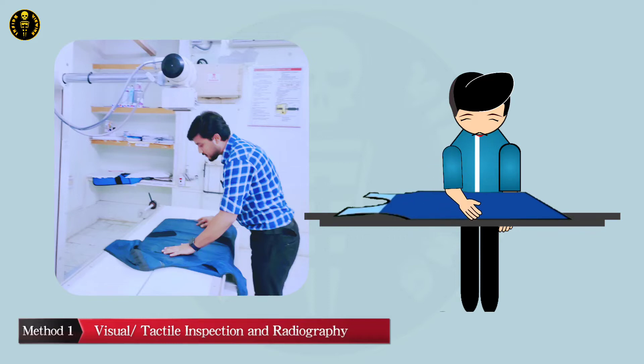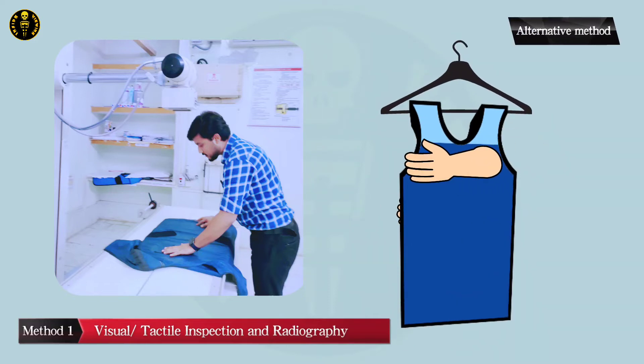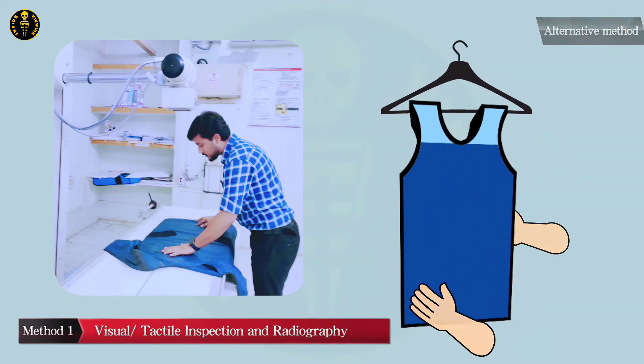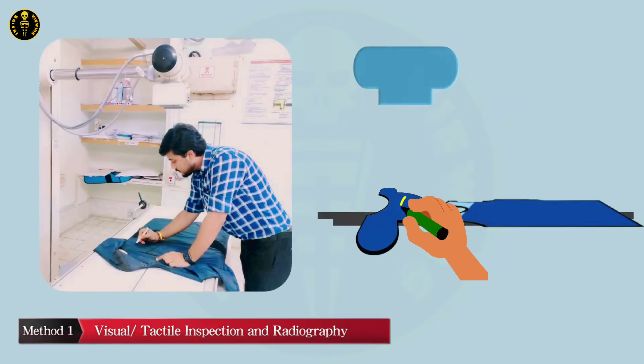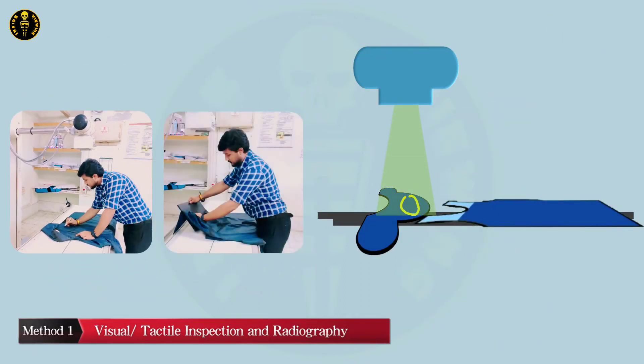For tactile inspection, run your hands over the entire inner and outer surface of the apron to find any thinning in the lead lining, any cracks or holes. Then mark the suspected area and take a radiograph.